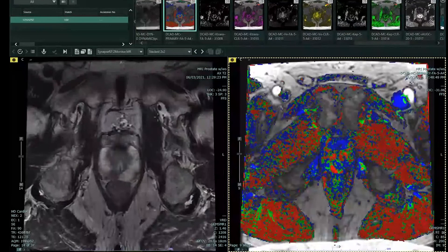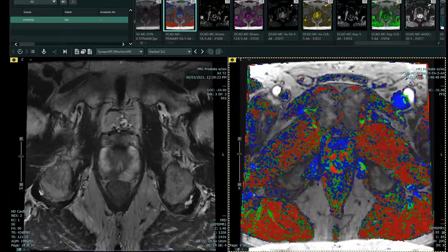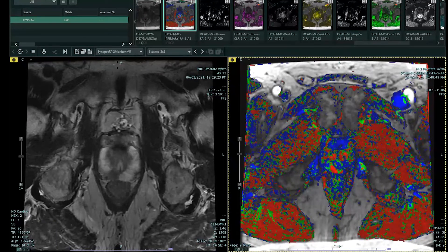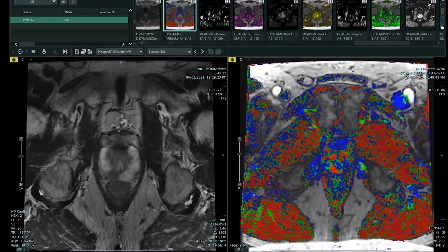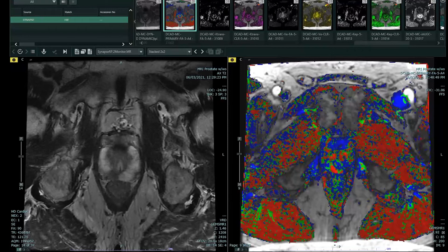These are two images from a prostate MRI. This image is an axial T2-weighted image. The patient is lying on their back — this is the patient's front, this is the patient's back, this is the patient's right side, and this is the patient's left side. I'll draw your attention to the prostate, which is in the middle of the screen here.